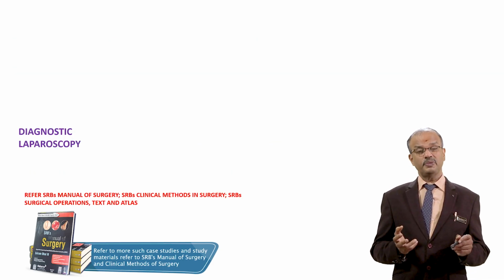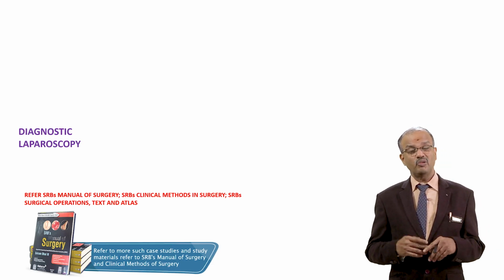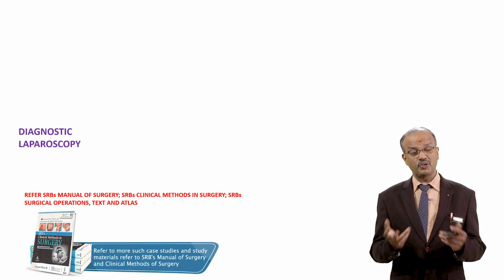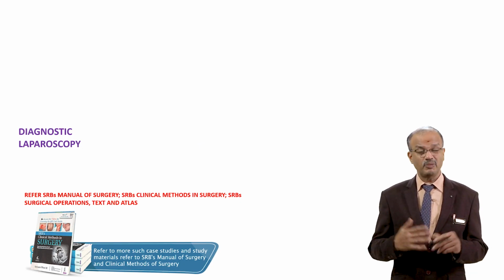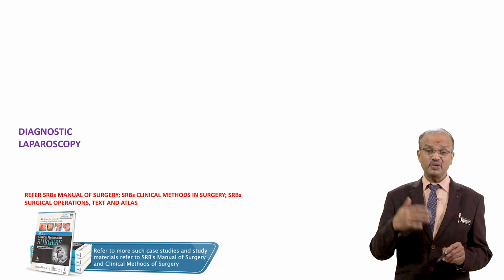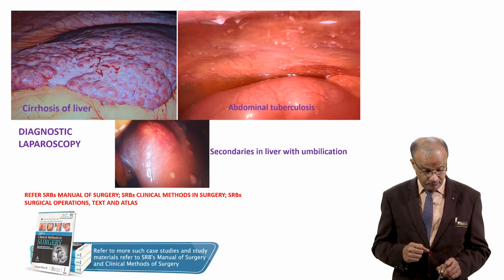So diagnostic laparoscopy is a basic thing for identifying diseases when all investigations are not very sure. We want to take a biopsy, a fluid, or tissue; laparoscopy helps identify it. You can take biopsy, you can visualize, peritoneal biopsy, omental biopsy, tissue biopsy, and fluid collection for analysis, AFB, tuberculosis, malignancy, peritoneal carcinomatosis, different malignancies, everything can be done. We can decide before doing surgery: if it is peritoneal malignancy, then radical surgery is not possible. So decision making also falls in laparoscopy.